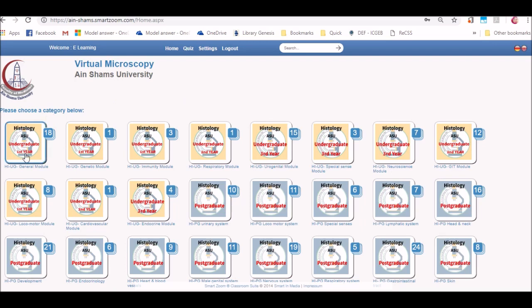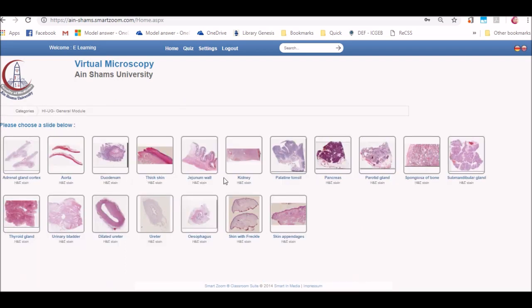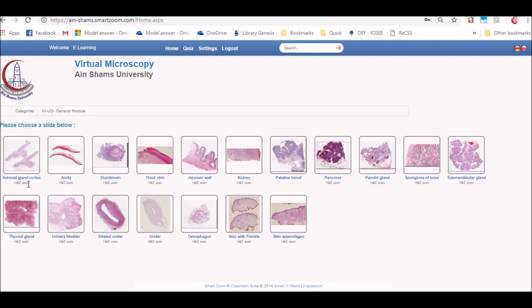In order to navigate, click on the desired category. For example, we will click on the general module of histology for the first year undergraduate. Now you can see all the slides included in this module, presented by their name and by their stain, which is H&E in most of the slides. Now I chose this slide to navigate and to inspect.